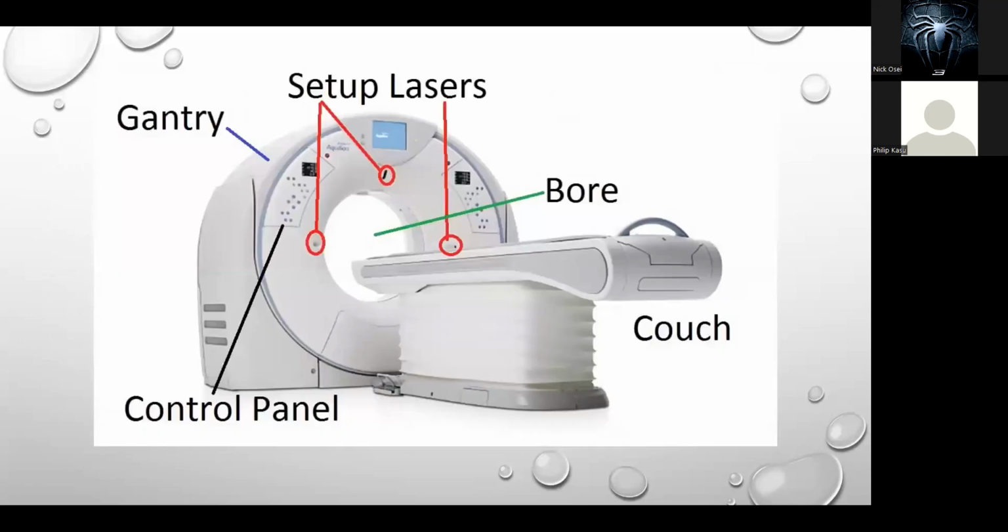So this is how a CT scan looks. Right from the word go, you realize that some of the limitations of a CT scanner are that it has a very huge setup. You can see this machine, very huge. So you need a very big space, and it is very expensive compared to the cost of an X-ray machine. It takes up more space than the traditional X-ray.